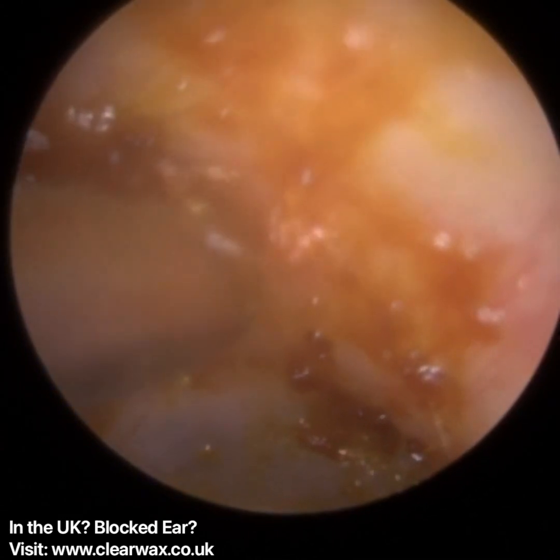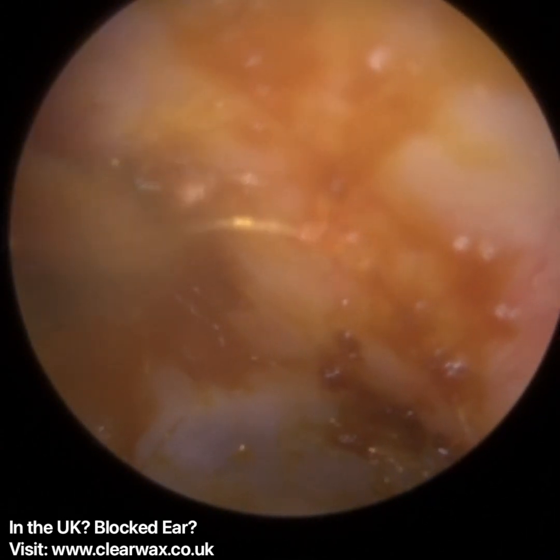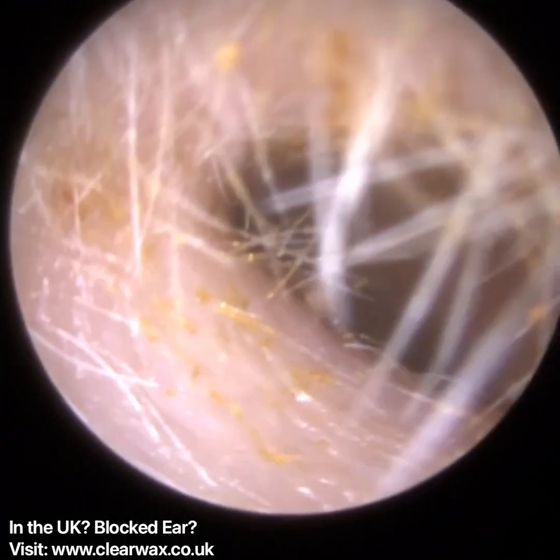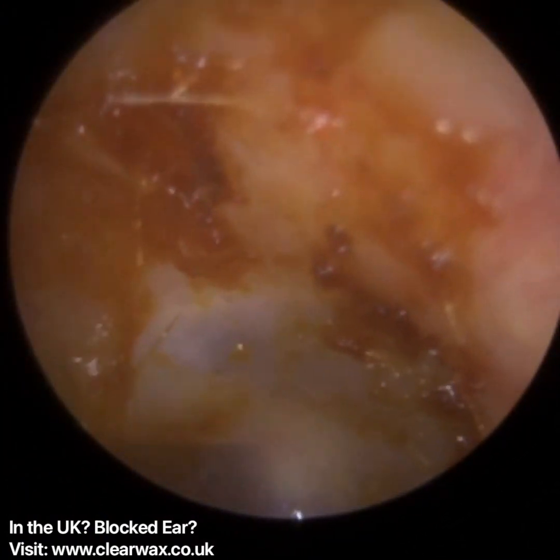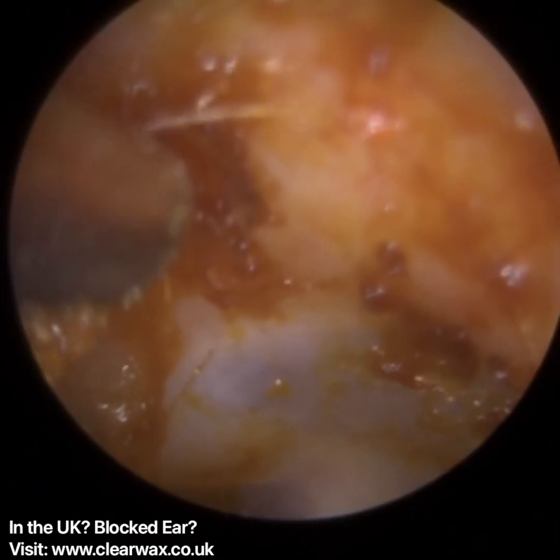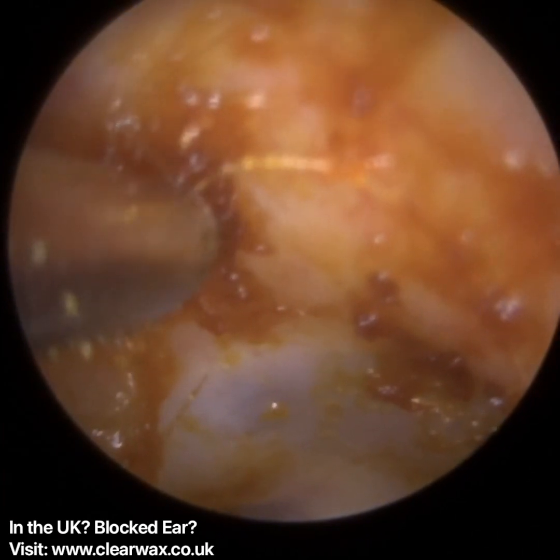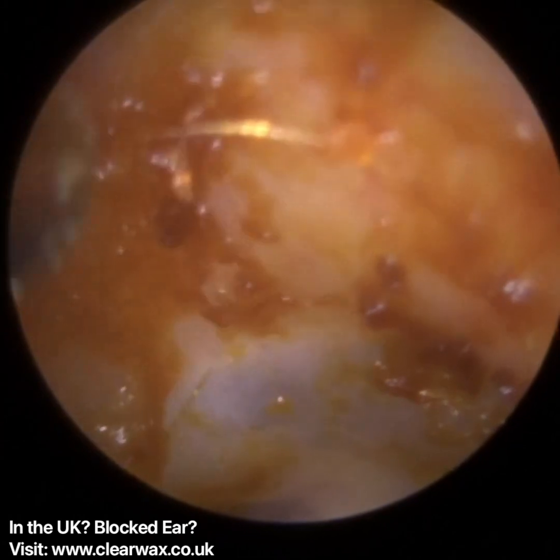Guys, it's really uncomfortable. I've had people in my ears during the Clearwax training course who have made contact with the bony part of my ear, and believe you me, it's not a nice sensation. I can compare it to having an exposed nerve in your teeth and having something cold to drink or eat, like an ice cream, and it stings. I experienced that myself, hence why I'm ultra cautious when I'm going deep into the patient's ear.